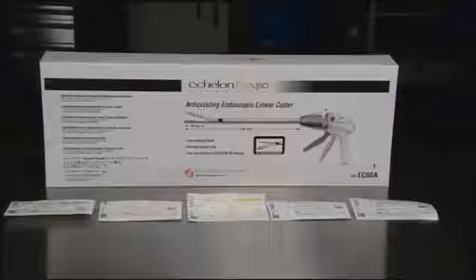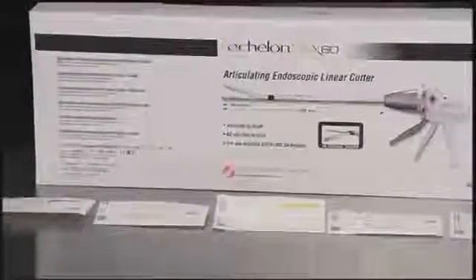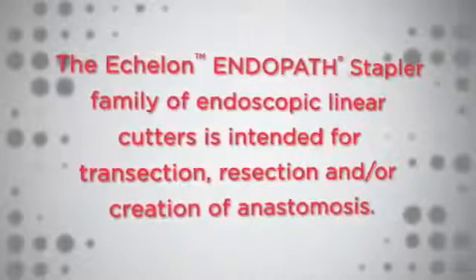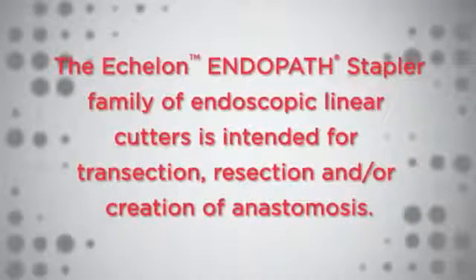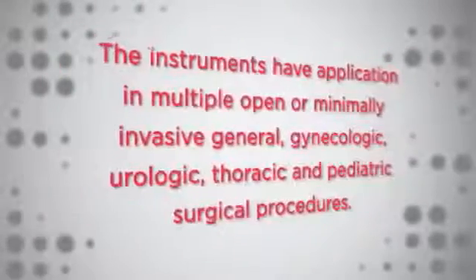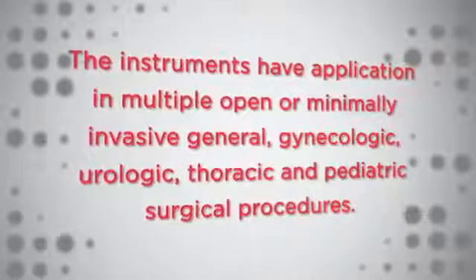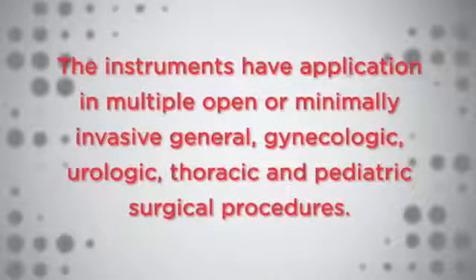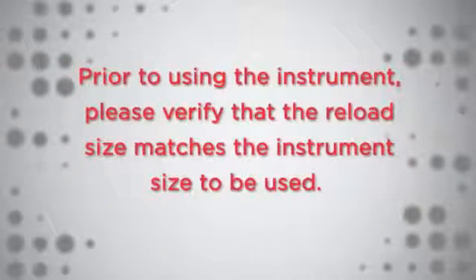Ethicon Endosurgery's Echelon Flex 60 Endopath Stapler from the Echelon Endopath Stapler family is a sterile, single-patient-use device. The Echelon Endopath Stapler family of endoscopic linear cutters is intended for transection, resection, and/or creation of anastomosis. The instruments have application in multiple open or minimally invasive general, gynecologic, urologic, thoracic, and pediatric surgical procedures.